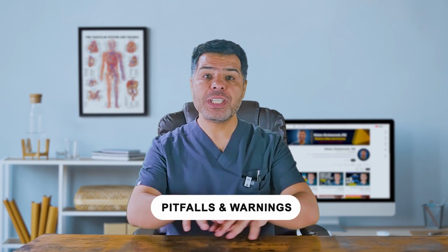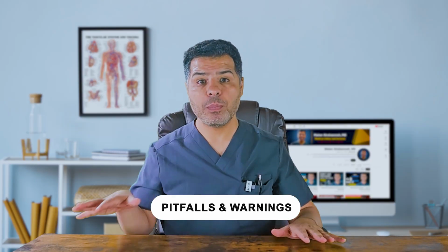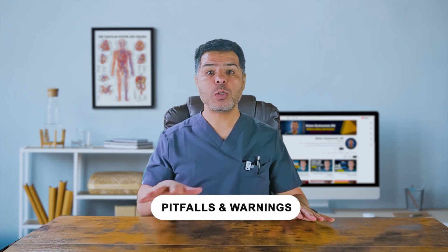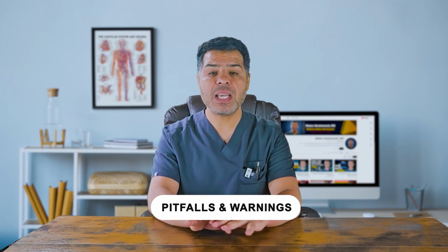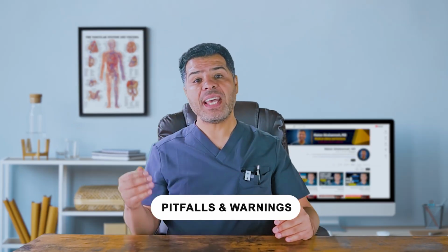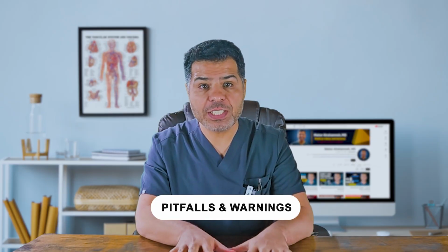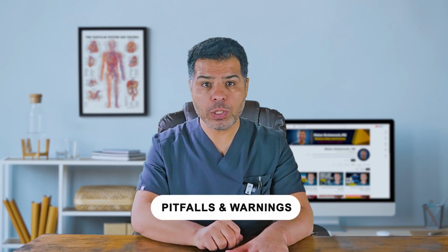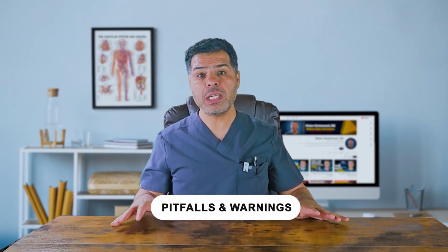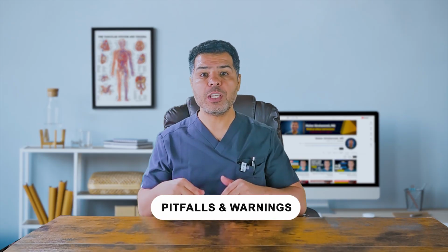And do not treat asymptomatic bacteriuria, please. Most patients with Foleys will have positive urine cultures. That is colonization, not infection. Only treat if there are systemic signs of infection. Watch for catheter obstruction. If urine output drops suddenly, do not just assume the patient is dehydrated or in acute kidney injury. Check the Foley and the tubing first. Flush it gently. If you cannot flush it or there is persistent obstruction, the catheter may need to be replaced.